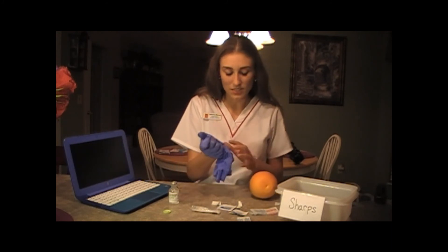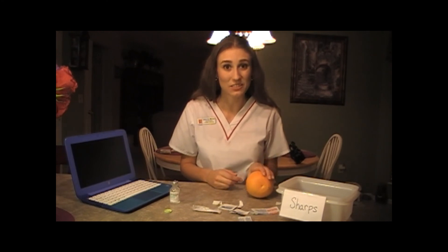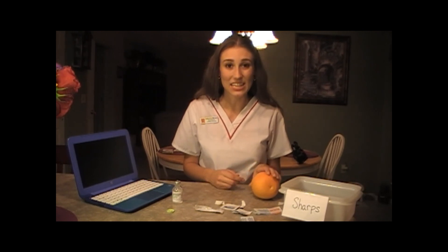I'm going to take my gloves off and use proper hand washing technique again. The last thing I'm going to do is make sure I document correctly. I'm going to document the medication I gave to this patient, the dose, the route it was given in, and the site — in the case of my patient, I gave it in their left deltoid. I'm going to document the exact time it was given, today's date, and if for whatever reason I decided not to give the injection, such as having to hold the medication, I would document that as well. And that's how you give an IM injection.